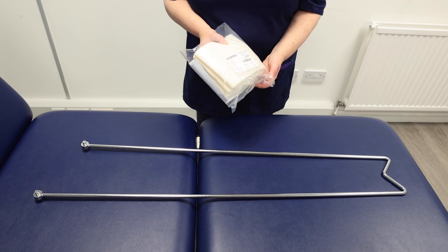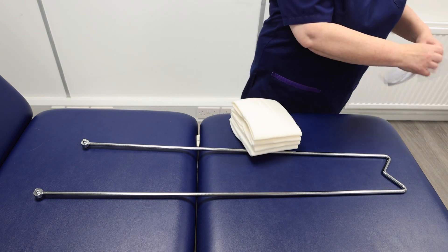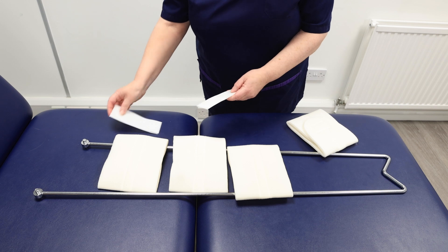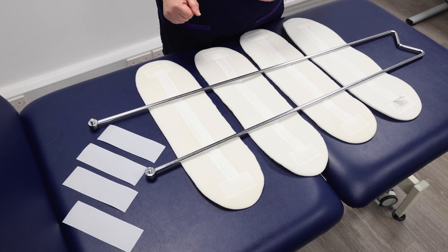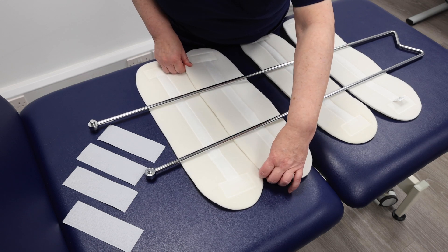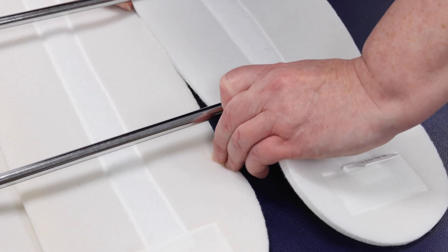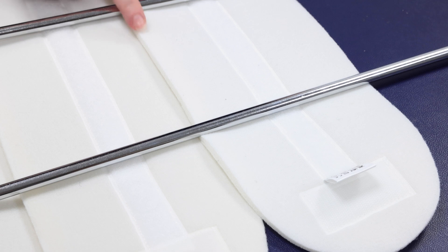Assemble the leg supports and sling. Lay out the foam pads and hook-and-loop straps on a flat surface. Proper placement is crucial — avoid spaces between foam pads to prevent tissue herniation and pressure problems. Avoid excessive overlap, which can create pressure points. A slight overlap is ideal.